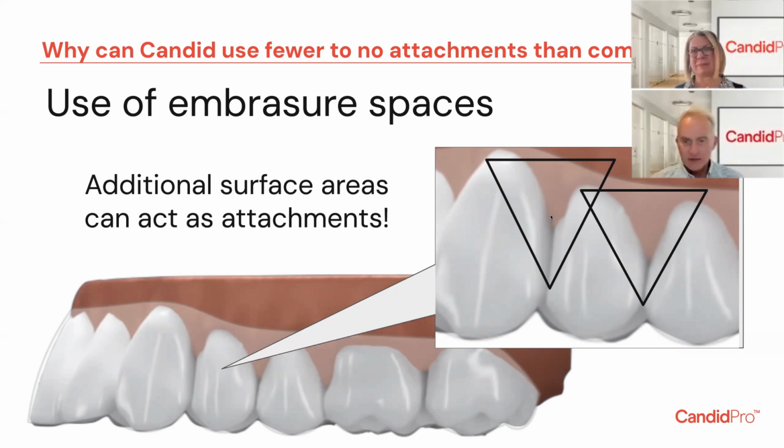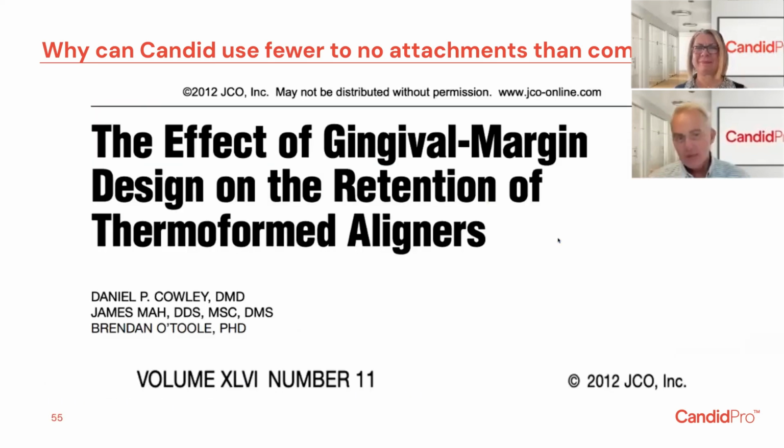The scallop trim is right at the gingival margin, but for me, when I was using scallop trim aligners, gosh, halfway through, that aligner really was pulling away from the gingival and was really losing contact with the tooth. So the straight trim can seriously take advantage of those embrasure spaces. So I love that. Now, let me go back to the trim again.